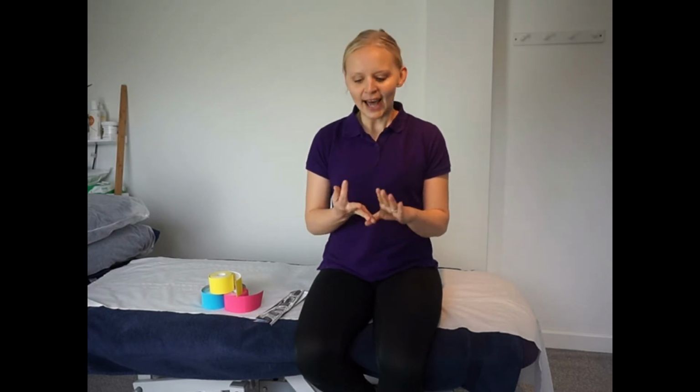So there are lots of different options of tape that you can buy. If you go online, you can find endless amounts of tape at various different prices. And we thought it is really important for you to understand the different types of tape that are out there and the quality of tape as well, because the quality is really important, as you want to make sure that the tape is sticky, that it recoils well when needed to, and also it's made of good quality materials.